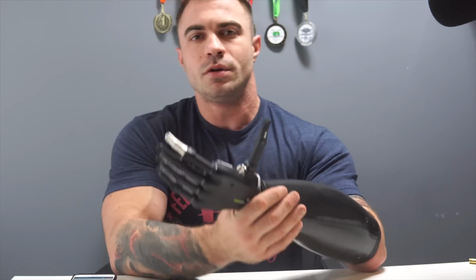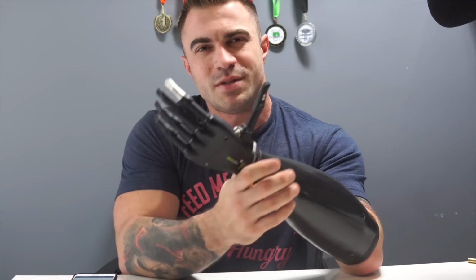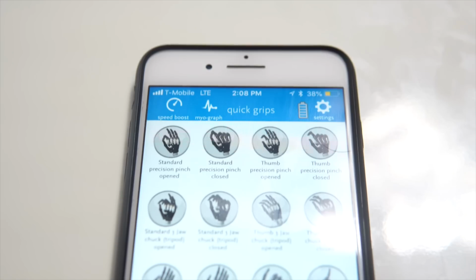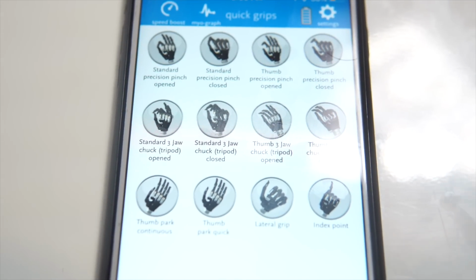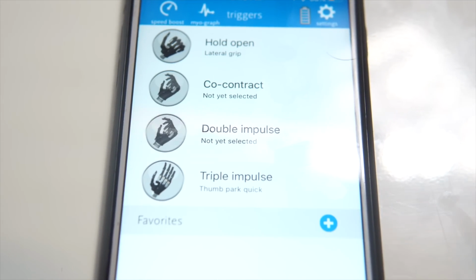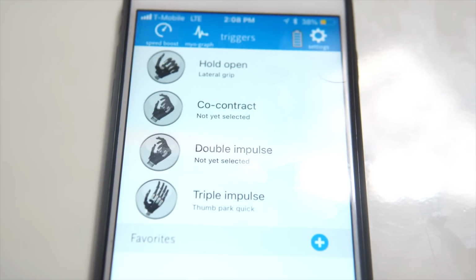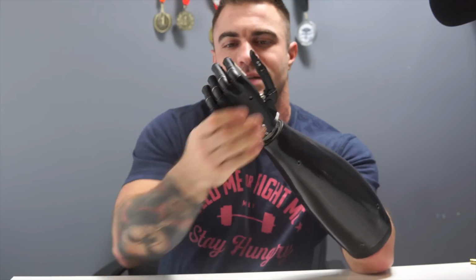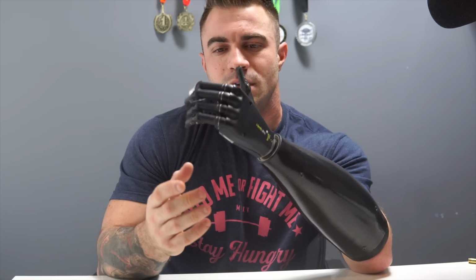So something else cool, some of the other settings, the way you set these different gestures is 21 different ones. You have to basically assign it a movement, whether you want it to hold open, like I did for the thumb, or squeeze, or co-contract, where you fire both muscles at the same time, or double impulse one muscle, or triple impulse one muscle. Yeah, this thing gets pretty crazy. That's a little look into what's going on.